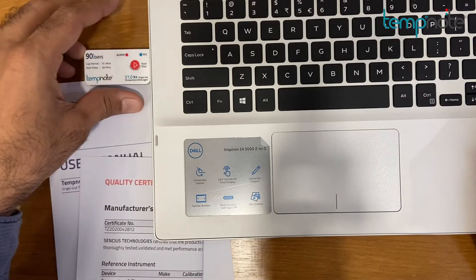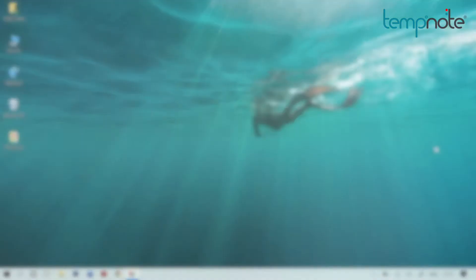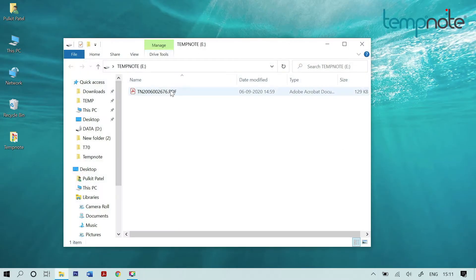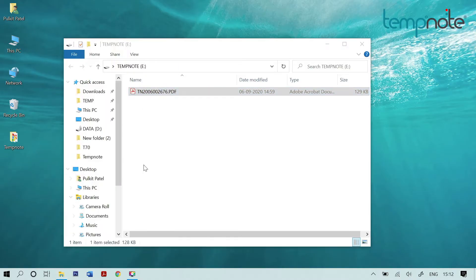Connect the device USB plug to the USB port of your computer. As soon as the device is connected to the computer, a folder will pop up with the PDF data report file. The PDF file can be copied and pasted at the desired location on your computer.